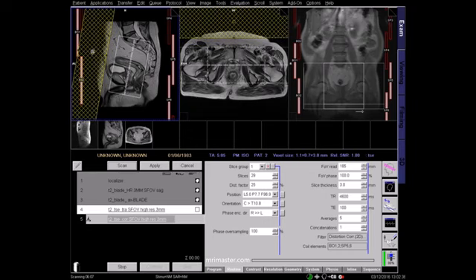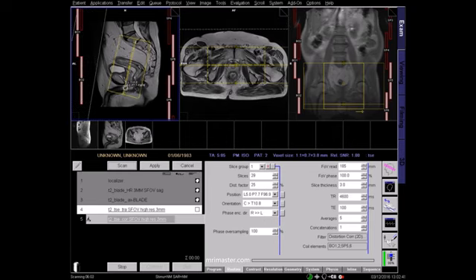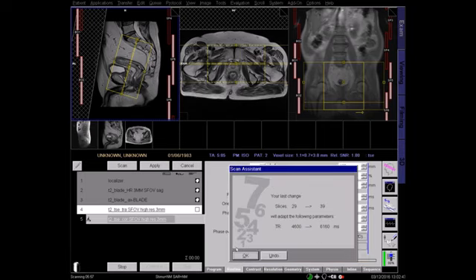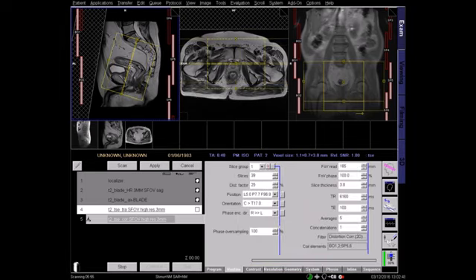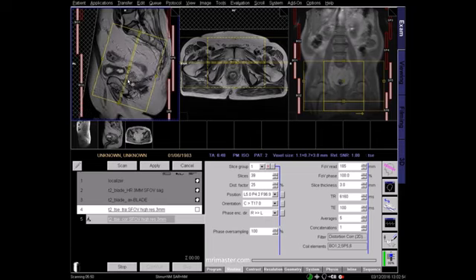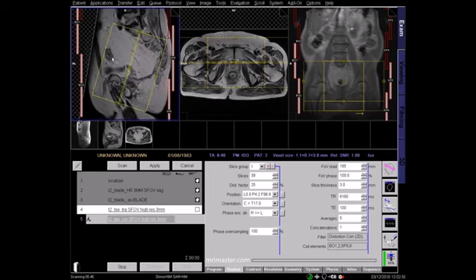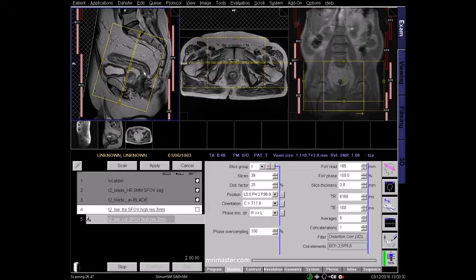Again, ensure coverage of the anatomy and increase slices or field of view if required. Ensure coverage of the presacral space. In this planning, you'll notice there's a coronal view of the lower rectum and an axial of the upper rectum and sigmoid colon.